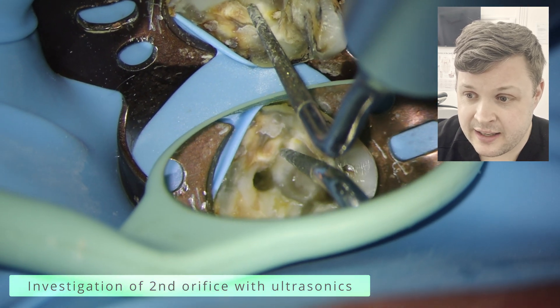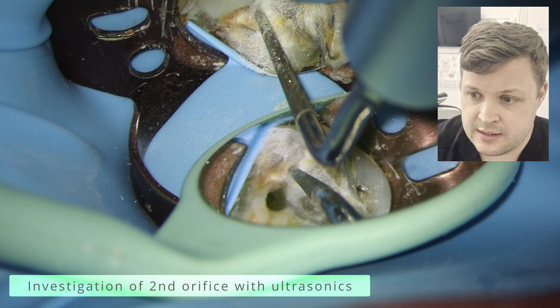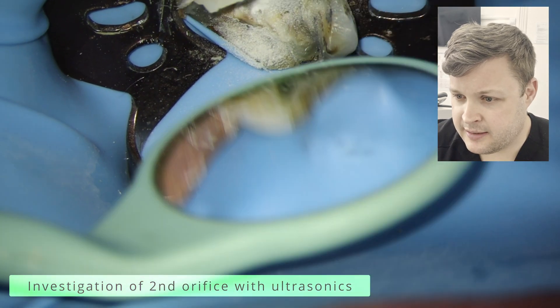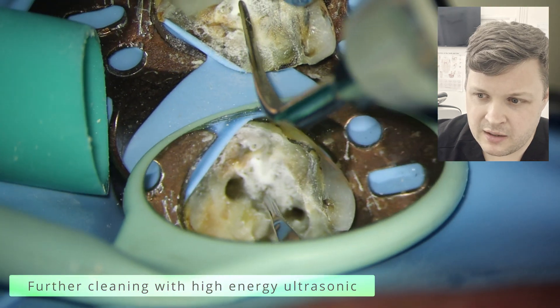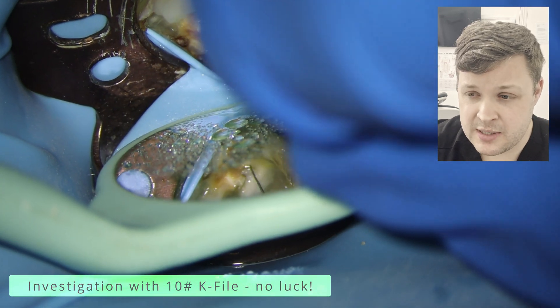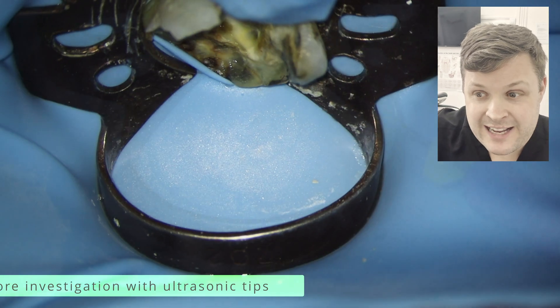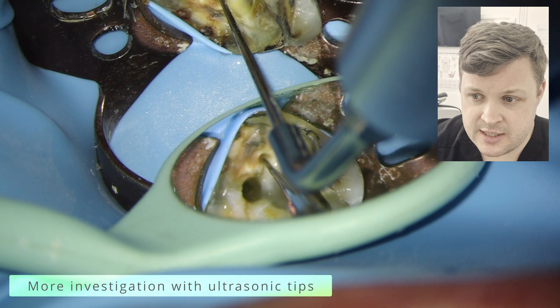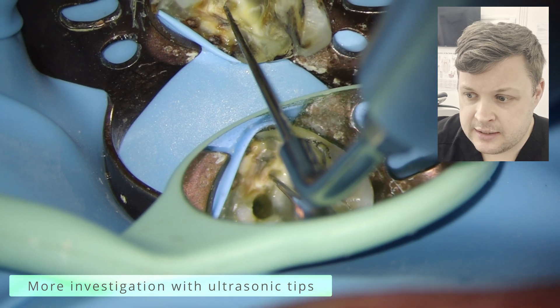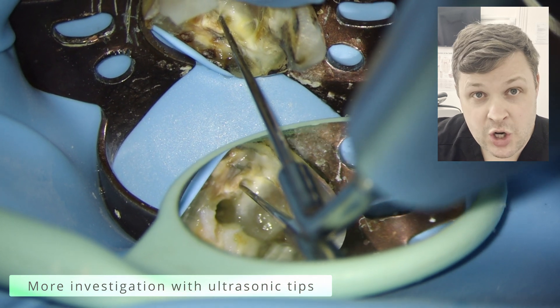Right down the middle there's a possible developmental line suggesting a second canal. I'm using diamond-tipped ultrasonic tips to very judiciously remove some of the dentin. There's no obvious drop — that could mean there's no canal, or that I haven't gone far enough. A great technique is to use high-energy ultrasonic tips, which will vibrate into the canal space if there's only a thin roof of dentin over it. I've moved to really thin-tipped instruments and I'm gently searching around, but I'm honestly just not convinced there is a second canal here.